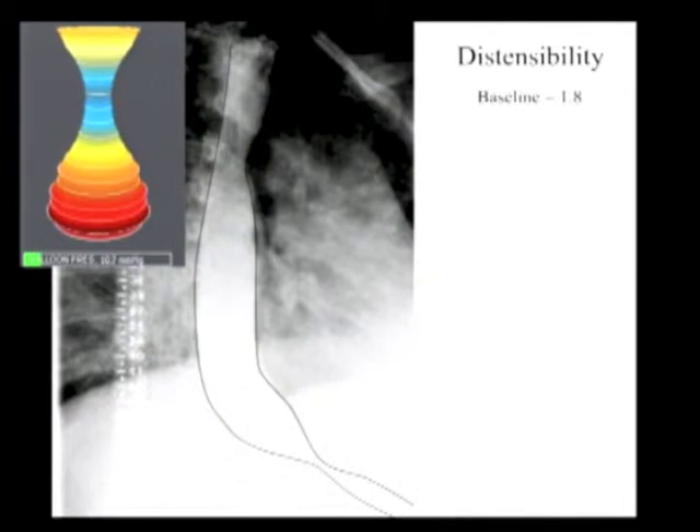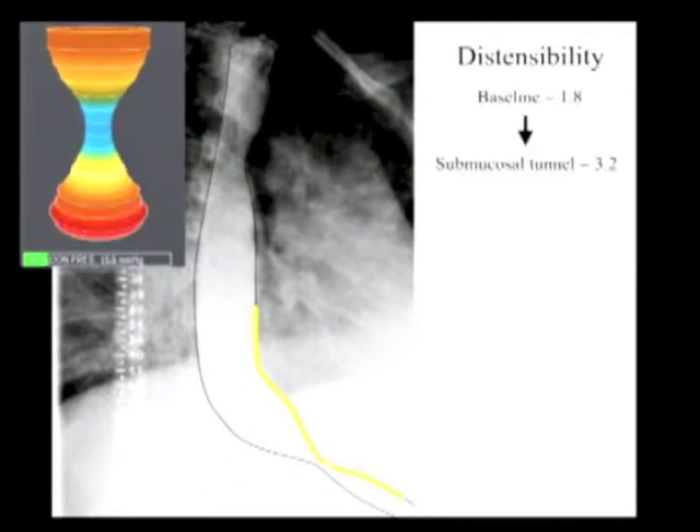After tunnel creation, we recheck a FLIP measurement. As we can see here, addition of the submucosal tunnel — the full length of which is indicated by the yellow line — has almost doubled the distensibility at the EGJ, and this is prior to any myotomy.